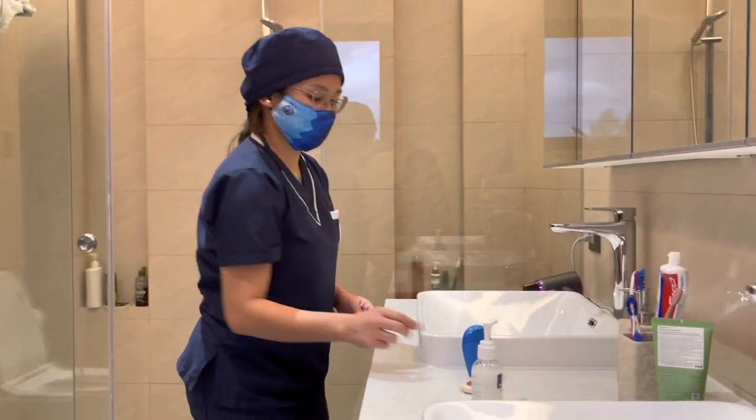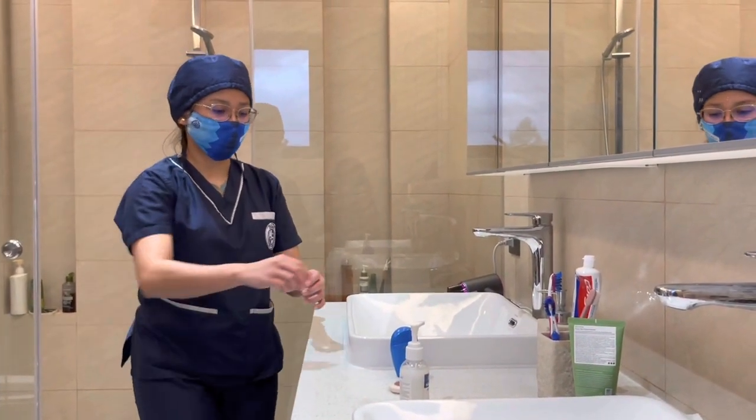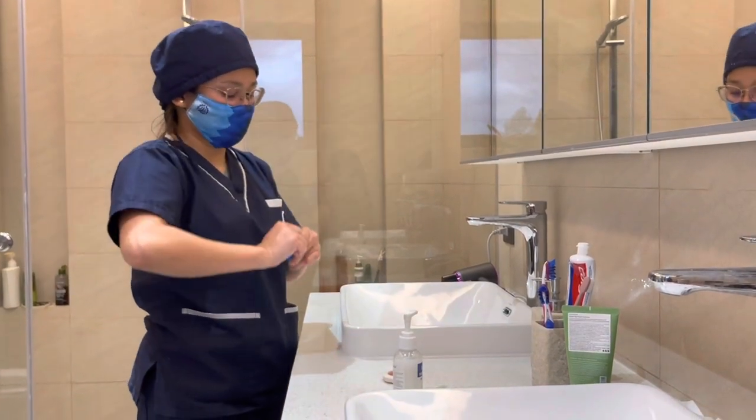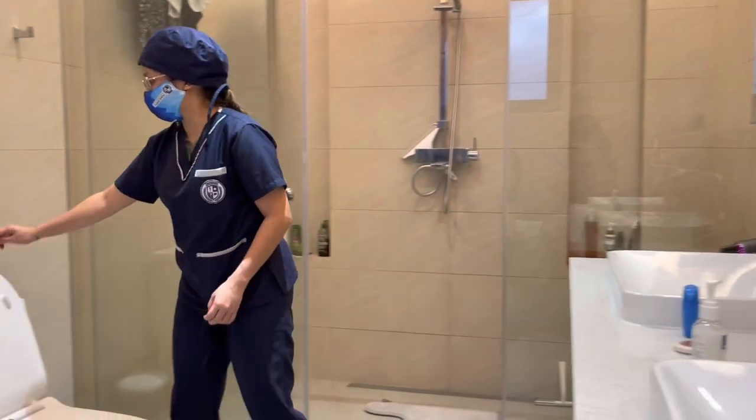Use a spatula to obtain the stool specimen. Close the specimen bottle tightly. Discard the remaining stool into the toilet bowl. Clean and dry the bedpan.